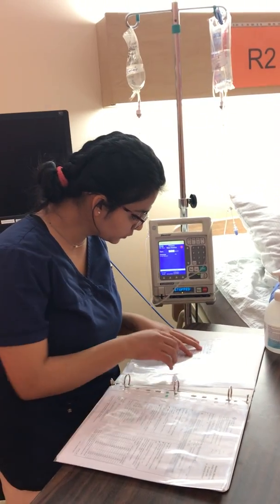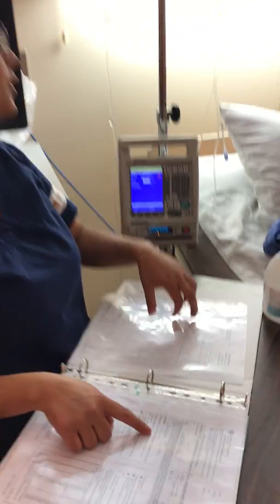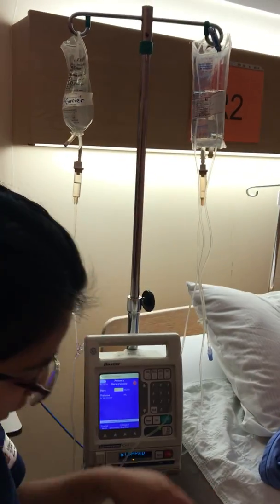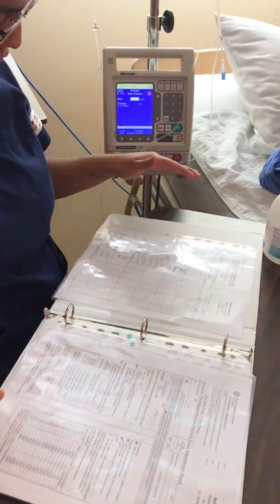It's also the right concentration, 100 units per mL. And it's running at the right rate, which is 1350. Now I'm going to put this away, so I'm done with my physician order.